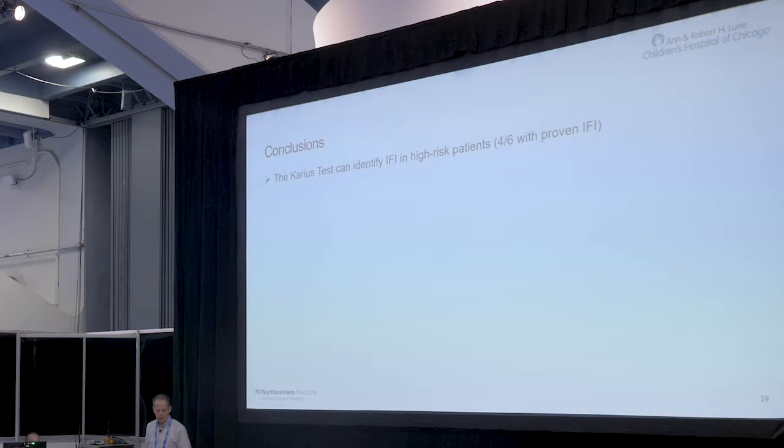So I'm going to summarize our study. We were able to demonstrate that this test can provide positive results for invasive fungal infection in high-risk patients, potentially avoiding biopsy in some of these patients. In our case, 4 out of 6 with proven invasive fungal infection by EORTC criteria. I noted that prolonged antifungal courses are common, and if this testing can be shown to have good negative predictive value, there's the potential for avoiding prolonged antifungal exposure in a lot of our patients.